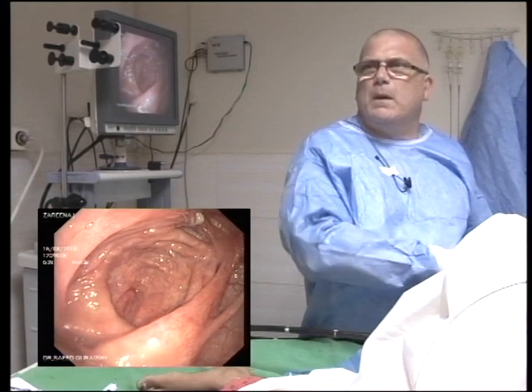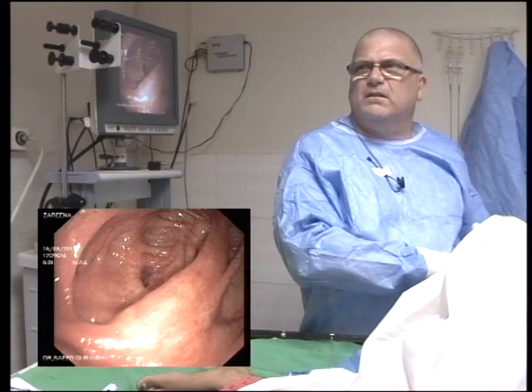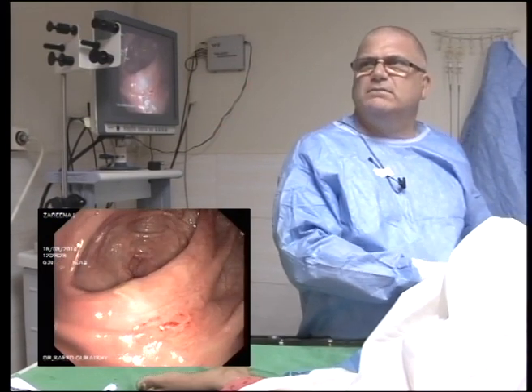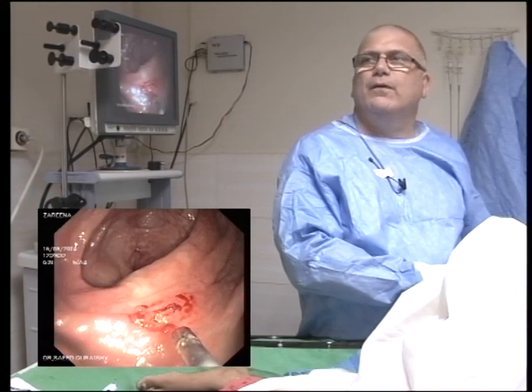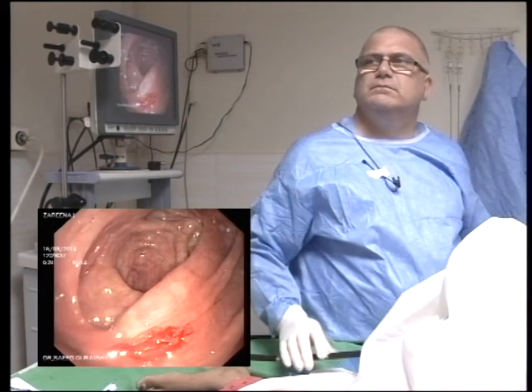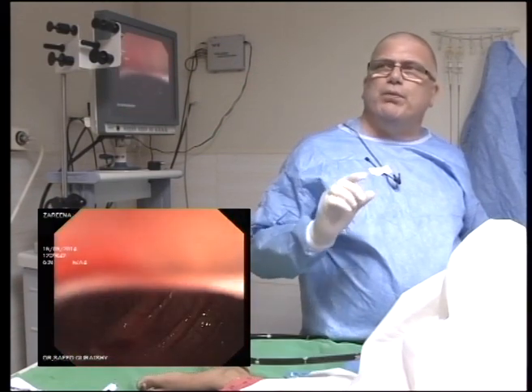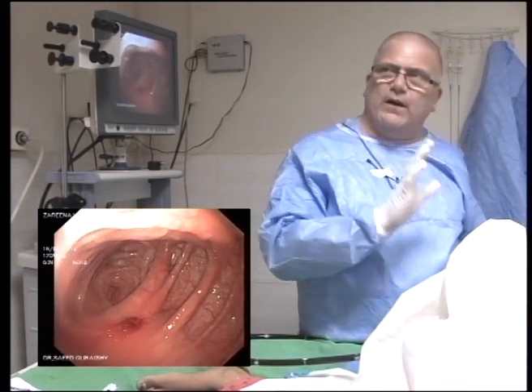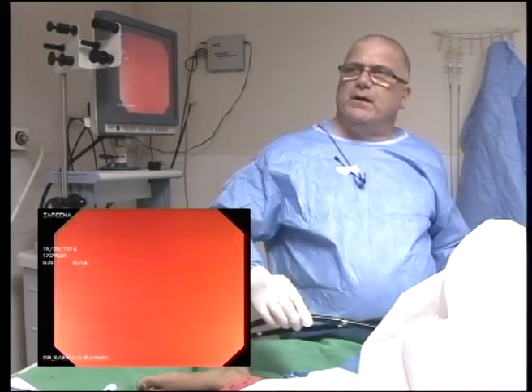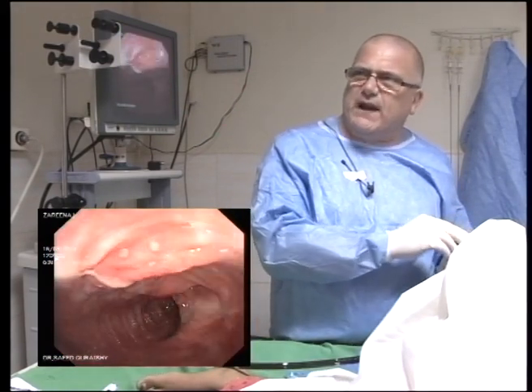All we can see is the colon doesn't look like a normal colon at all. And it's pretty diffuse. Close. Open. Close. So did you see what I did? Yes, we saw. That's to see right round the colon, so I didn't push too far in at all. What we will do is take some more biopsies as we come back, and I'll do a better demonstration when we get into the rectum.